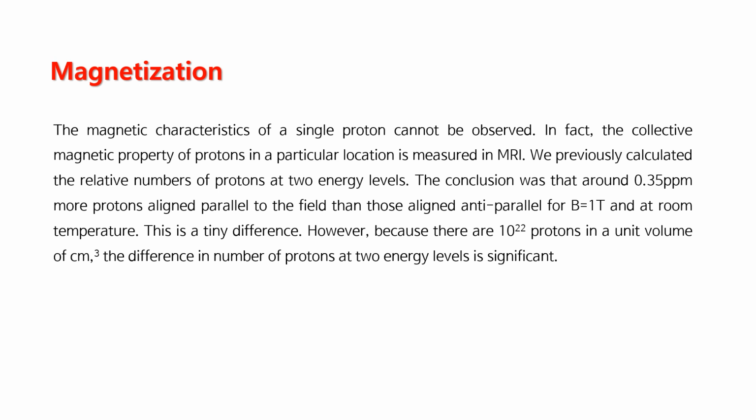Let's start with the definition of magnetization. The magnetic characteristics of a single proton cannot be observed. In fact, the collective magnetic property of protons in a particular location is measured in MRI.